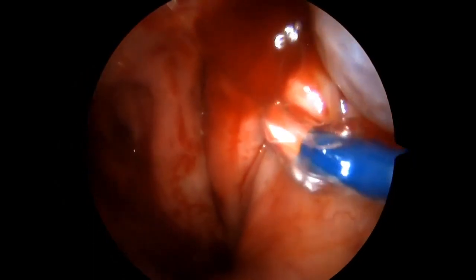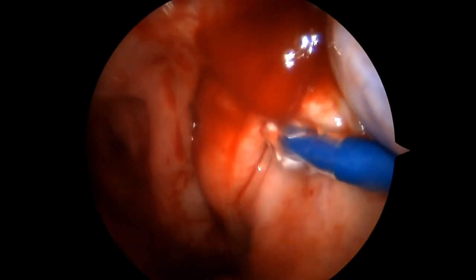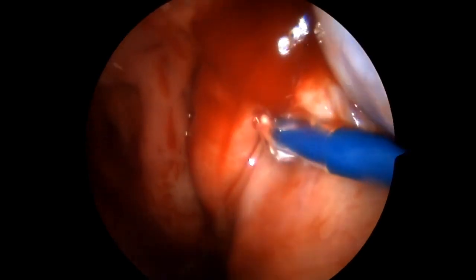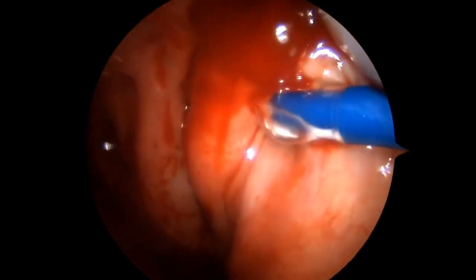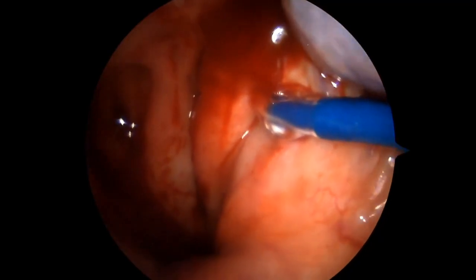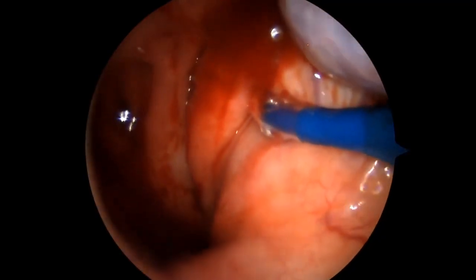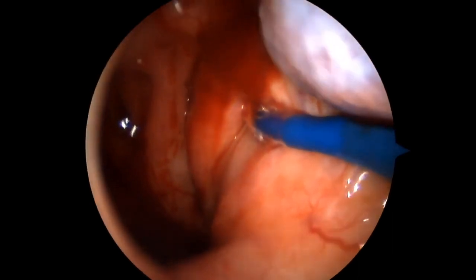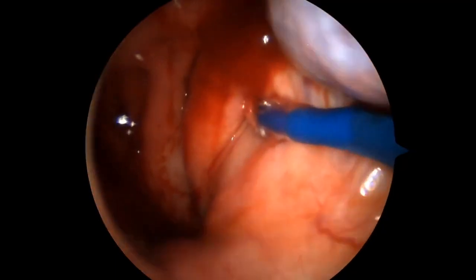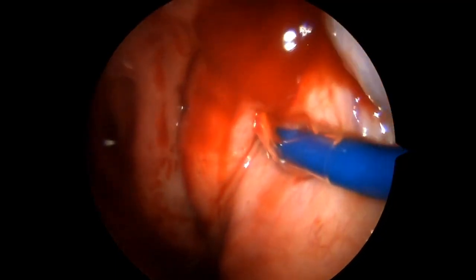Now, there are depth markers that are marked out in centimeter hashes, and so about a 2 centimeter insertion is the max that you want to go, because the eustachian tube is between 3 and 3.5 centimeters in length, but the last centimeter and a half or so is bony, so you don't want to advance into the bony portion of the eustachian tube. And then you advance the balloon and then inflate it as per the instructions.